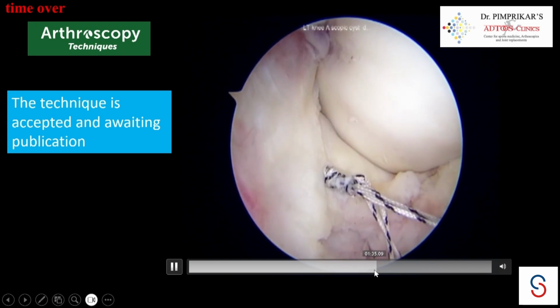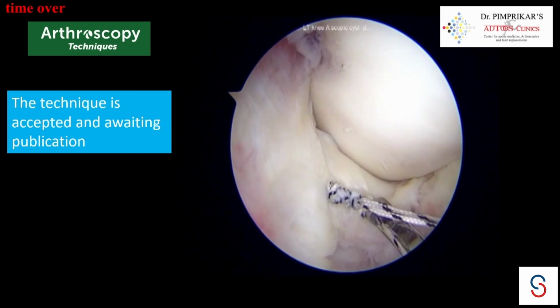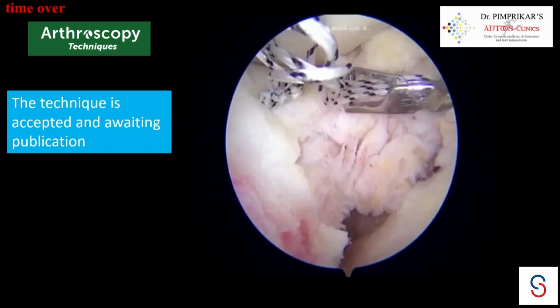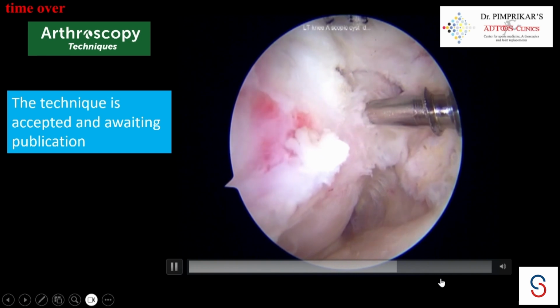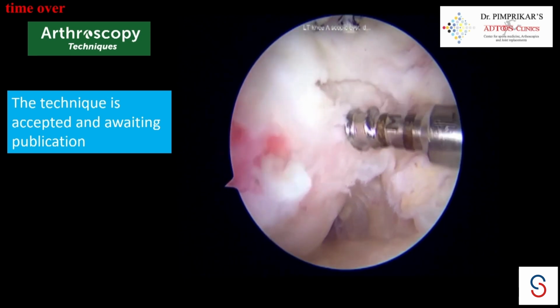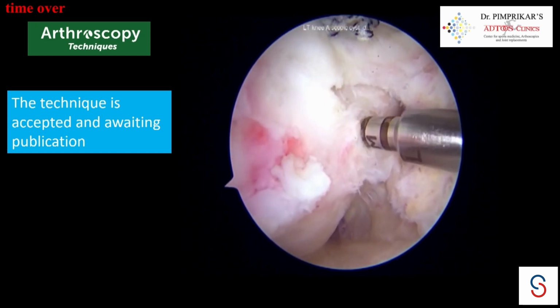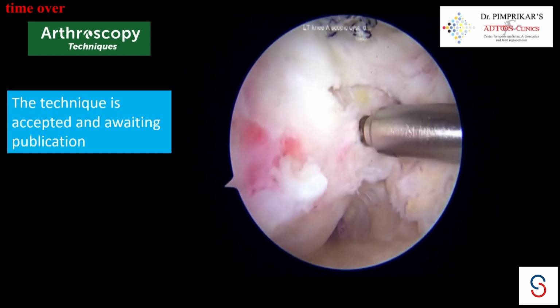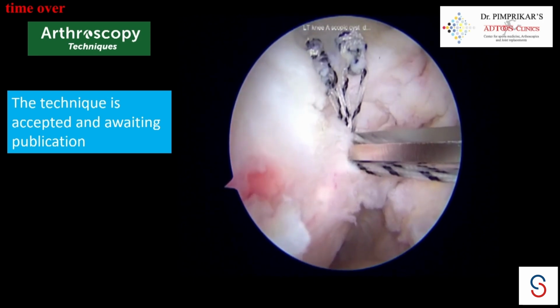And then you take this through a knotless anchor and insert that knotless anchor onto the anterolateral aspect of the tibia. So here what you're doing is you're securing your fixation. You're not strangulating the meniscus. You're repairing the meniscocapsular junction, and you can rehab these patients early, as you need not be afraid of the capsular structures giving way.